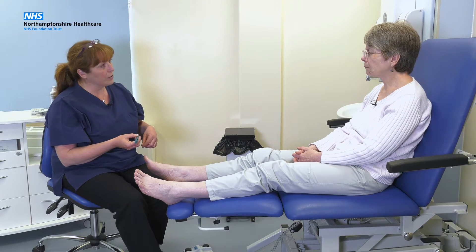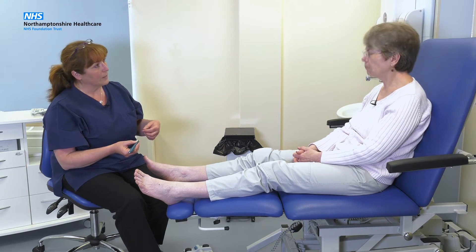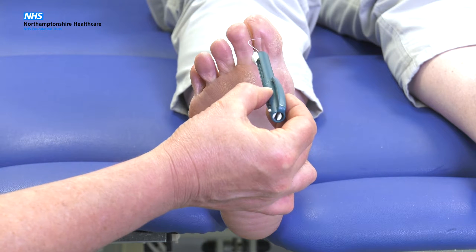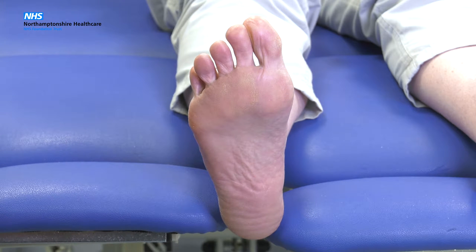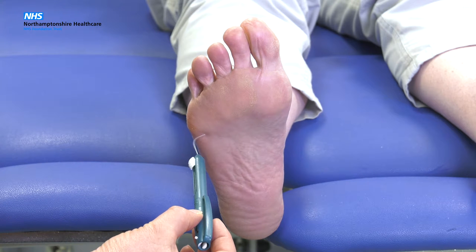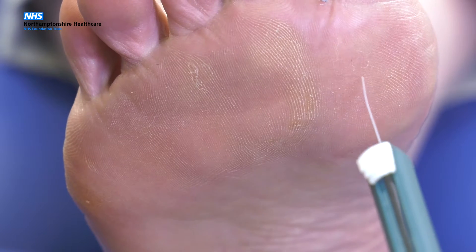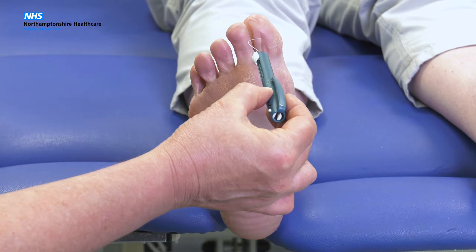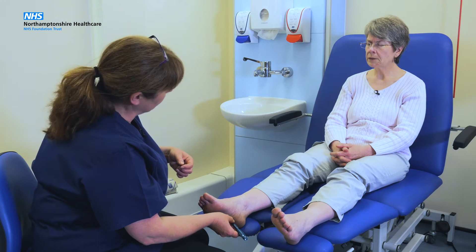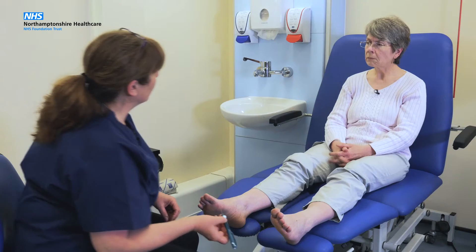If you can close your eyes, I'd like you to concentrate on your feet and if you feel any sensation at all on your skin, just say yes each time you feel something. [Patient responds: Yes — multiple times across test sites.] So that's the test for that foot, I'm going to test the other foot for you now.